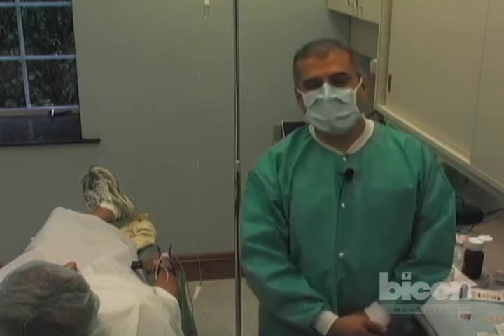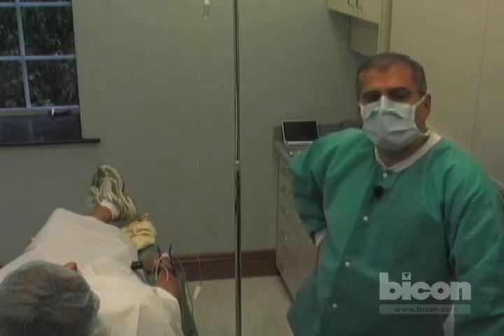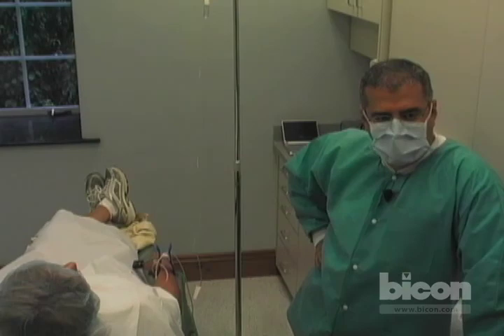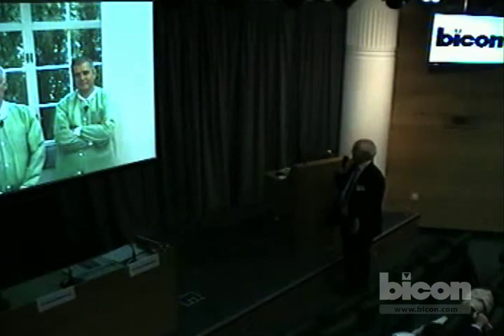Question: How long are you going to leave this before the second stage? Four to five months — no less than four, and more than five is not going to make much of a difference. That looks very fine, Shadi. This has been a very impressive demonstration. It is fantastic that we are talking in real time and watching surgery in Boston in real time. There is a lot of educational opportunity for the Bicon family worldwide to tune in for the future. Thank you very much for allowing us to be the first to receive this. You're entirely welcome.